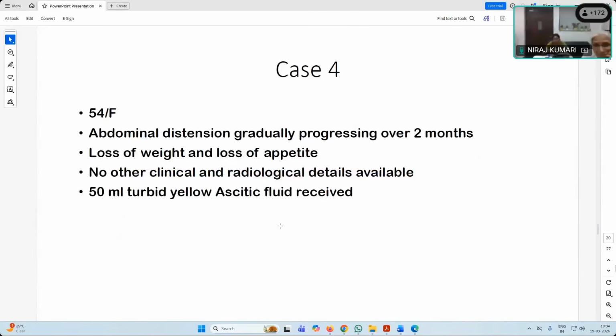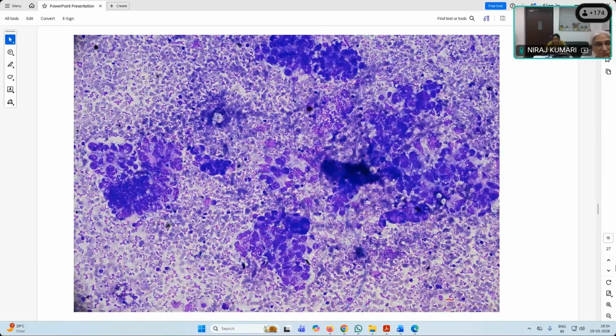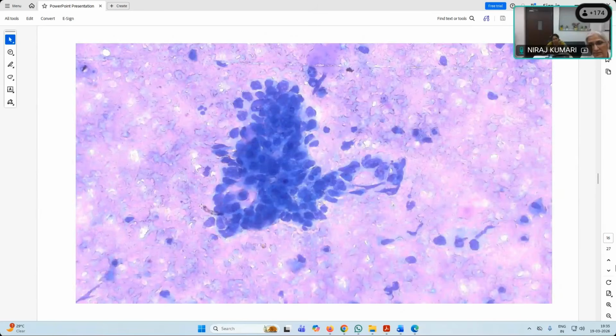Neuroblastoma, okay. So for neuroblastomas, we usually expect small round blue cells. These cells do not look too small or too blue, to me at least. You can see the cytoplasm here, and do you see the chromatin character as well? Is it very fine, homogeneous? You see the pleomorphism or the atypia, no? There is a moderate atypia. Some are oval, irregular. They're not that monomorphous, no?